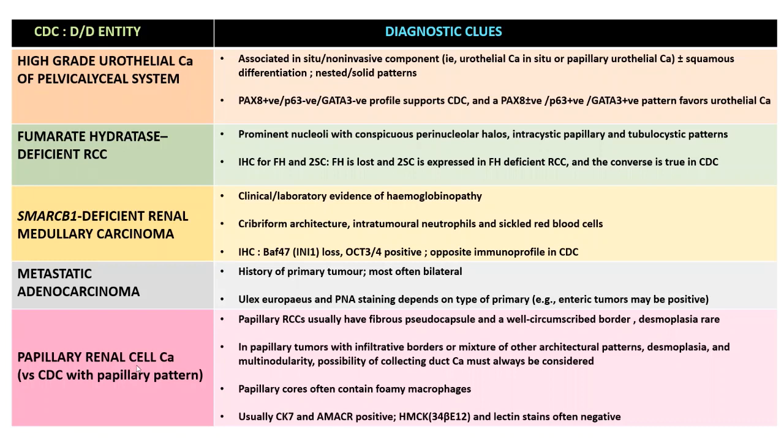Similarly, the inflammation that you see in the case of a CDC will usually not be seen in the case of a papillary RCC. And these papillae will usually contain foamy macrophages. They are usually positive for both CK7 and AMACR and negative for expression of high molecular weight keratins.